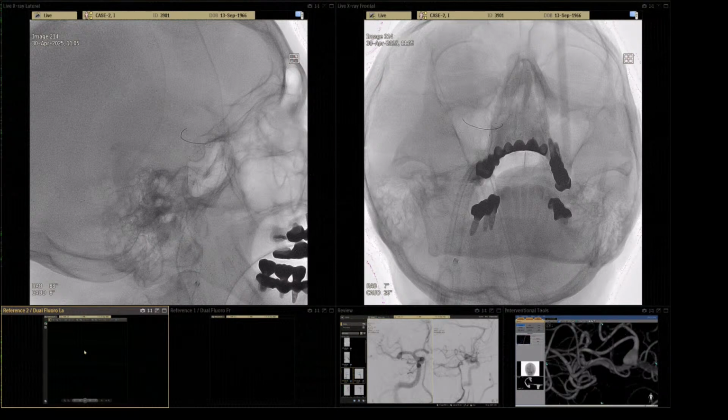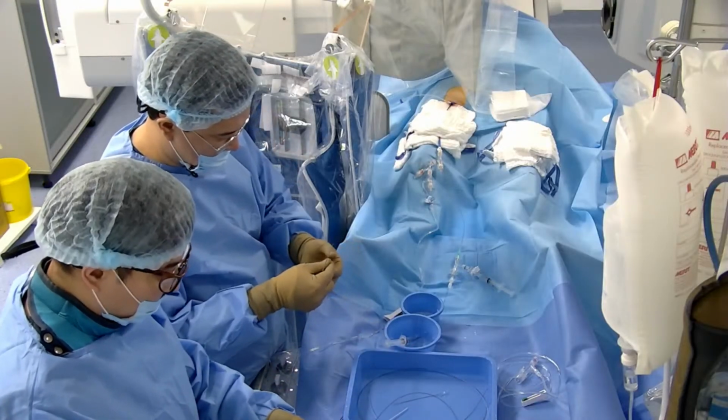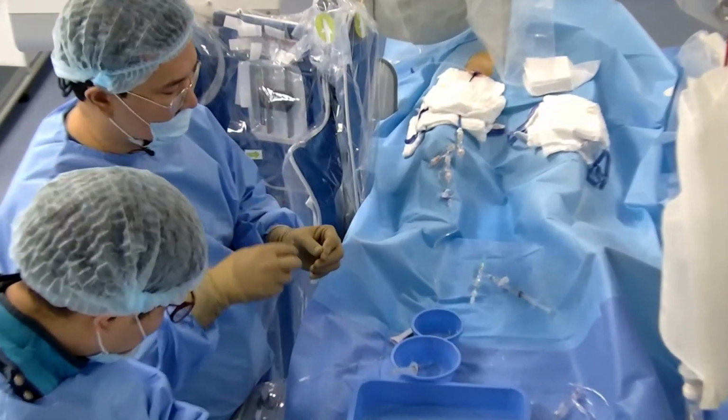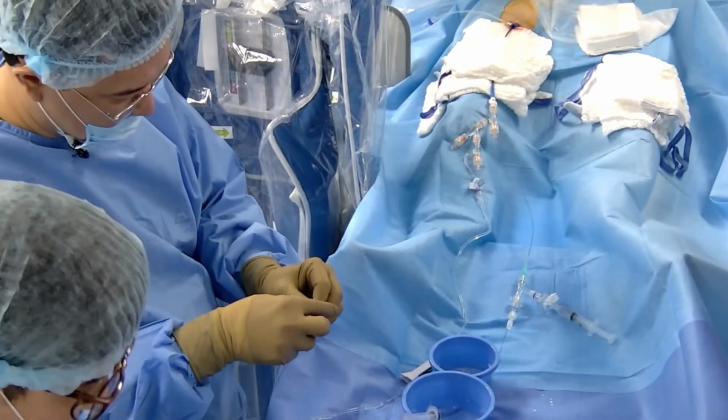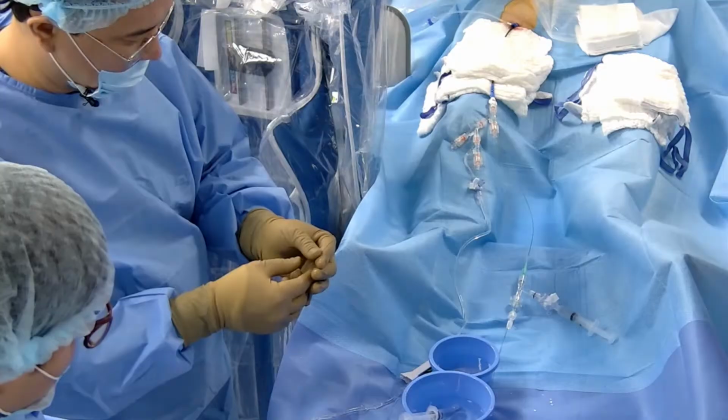Okay. Stop. It's just downstairs, and we need something like this. Okay, goes up.